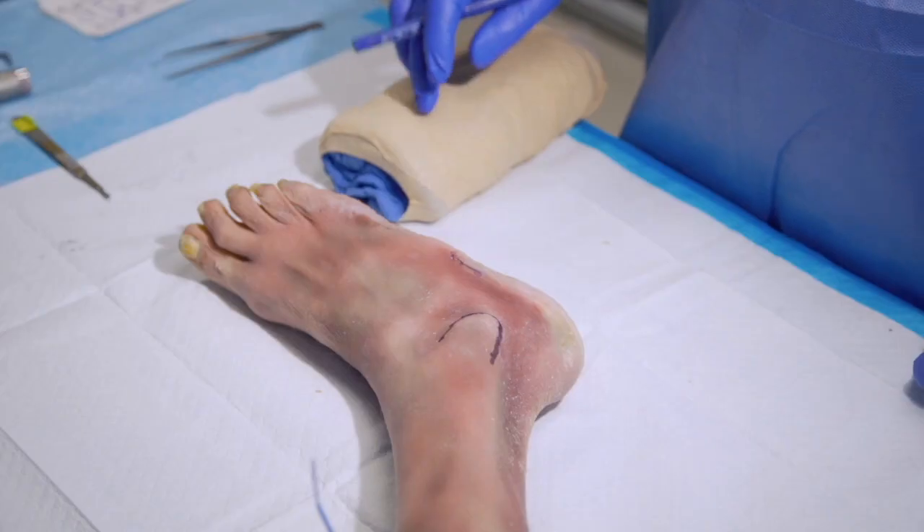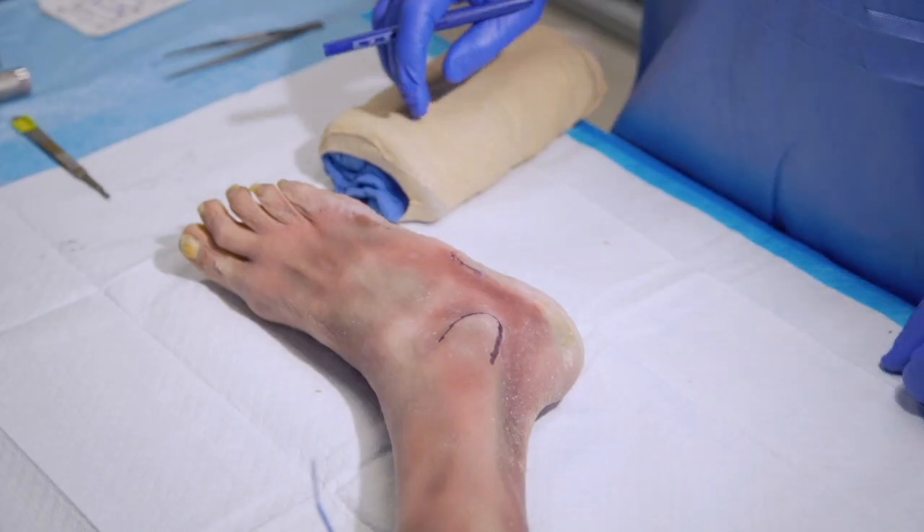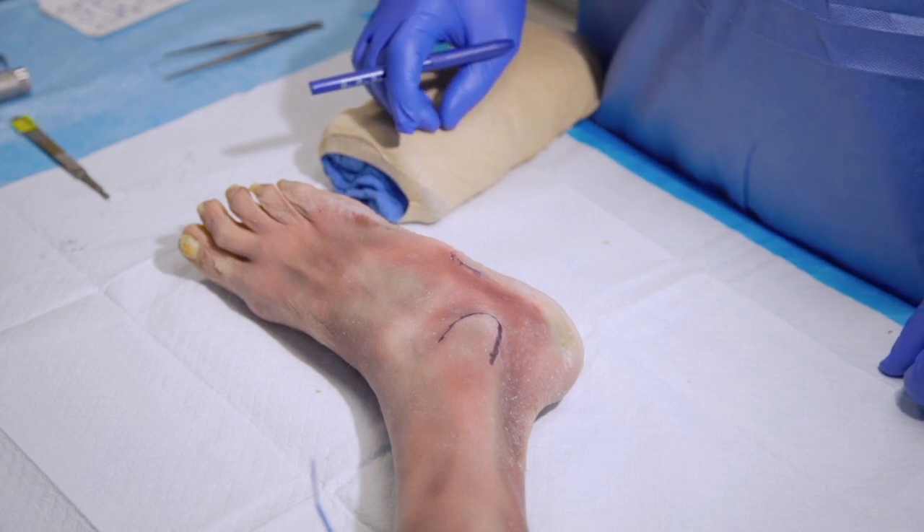Hi, my name is Mark Hardy and I'm from Cleveland, Ohio. My name is Jordan Grossman, I'm from Akron, Ohio. The procedure that we'll be demonstrating today is the subtalar joint arthrodesis utilizing the Fixos II cannulated screws, performed through a lateral approach.